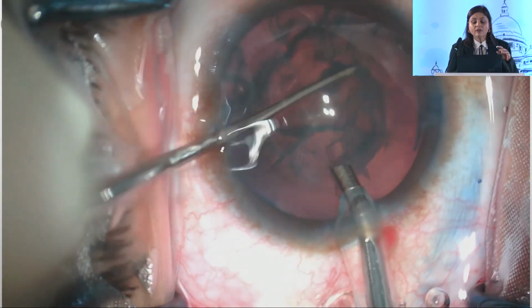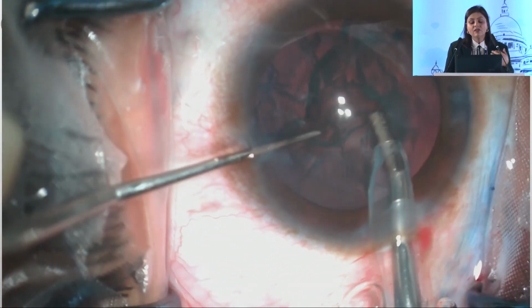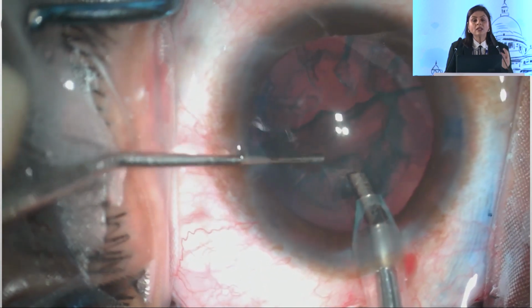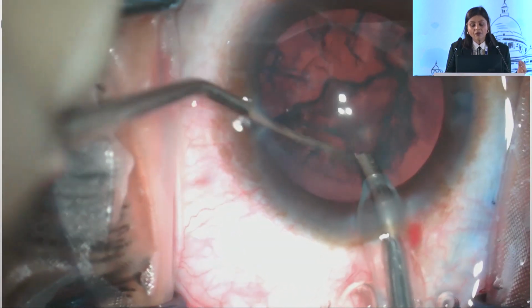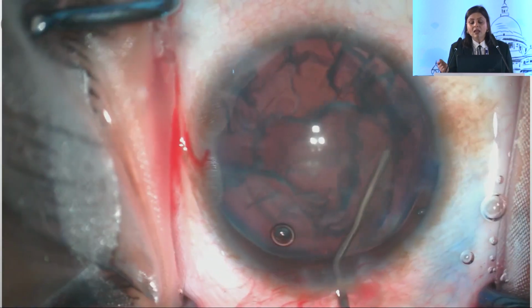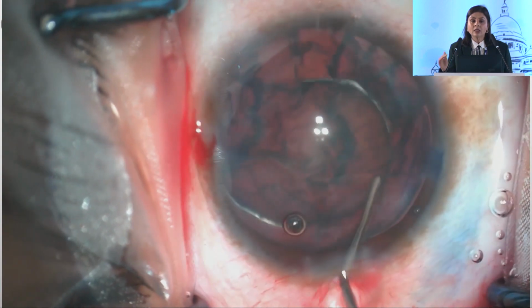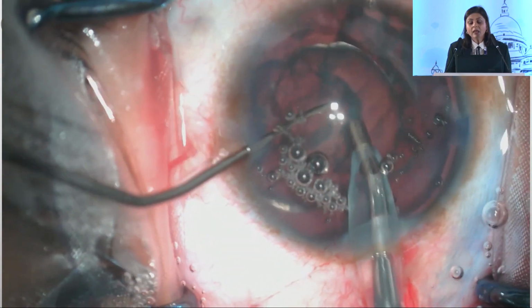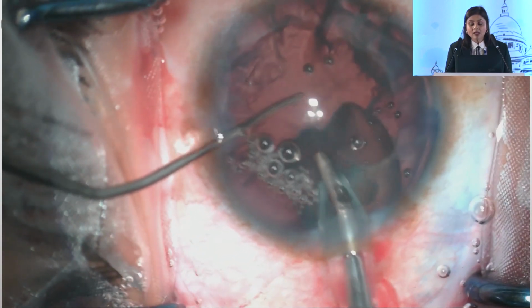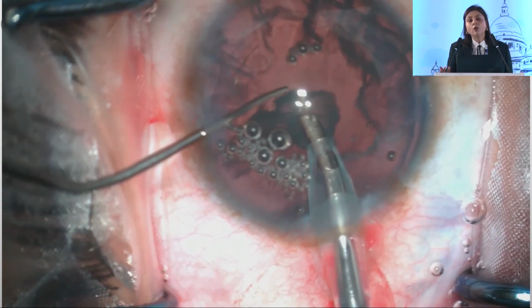And this makes it very easy for us to just emulsify the whole nucleus, as it is very difficult to chop since the nucleus is extremely soft in these cases. Now, if we find it difficult to remove this sub-incisional epinucleus and nucleus, we can pause, inject viscoelastic or dispersive OVD underneath it, and this will help us in prolapsing this soft nucleus up, and we hardly use any phaco energy in these cases.